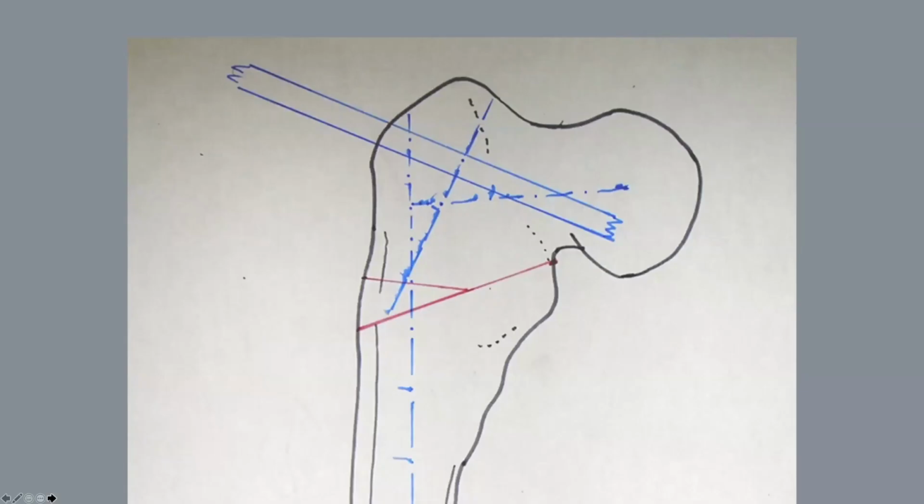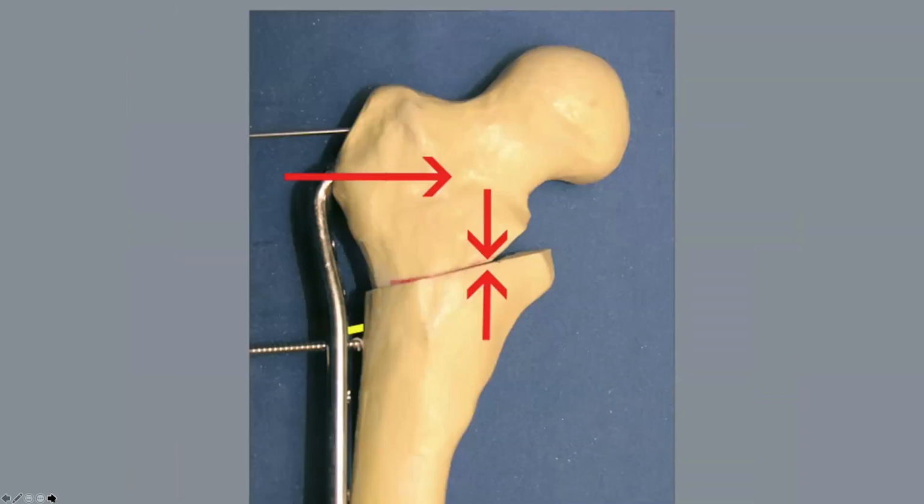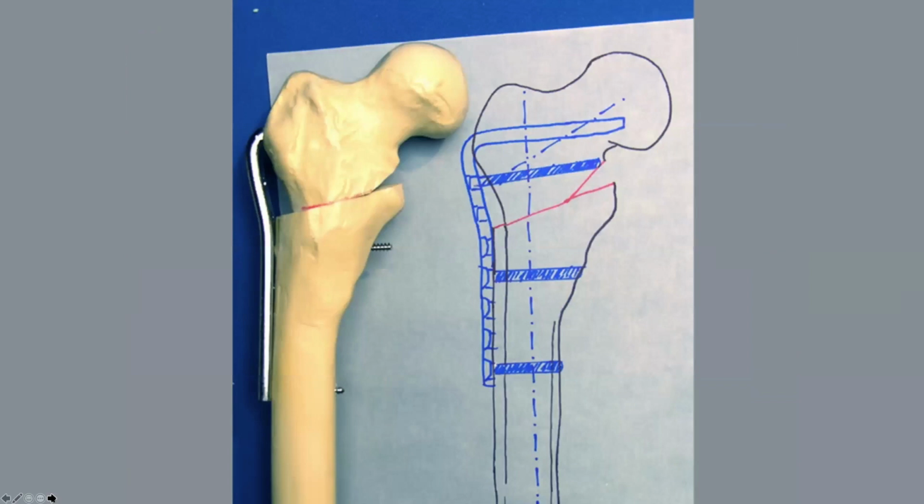So the question then is how do you take that preoperative plan that you've created and then execute that in the operating room? What you really want to do is to be able to go in the operating room, remove your wedge, put your blade plate in, get this offset compression so that you have good stability at the osteotomy site, and have it look like you had planned before the operation. But there's probably easily 50 steps in between here that you need to think about.